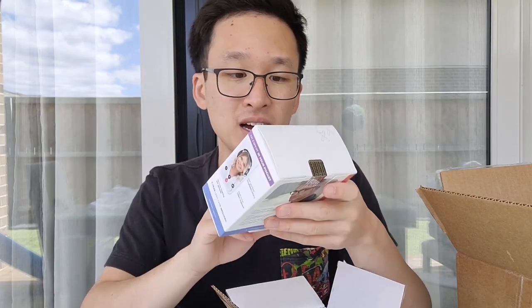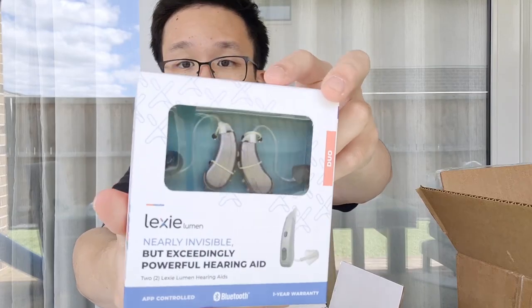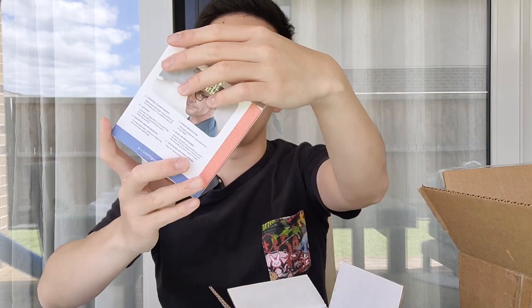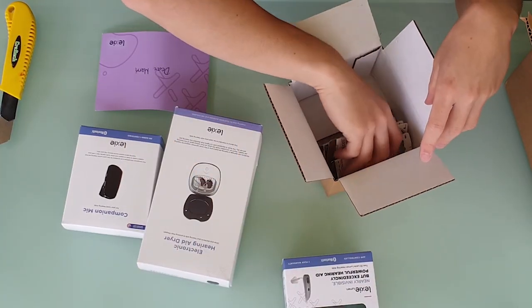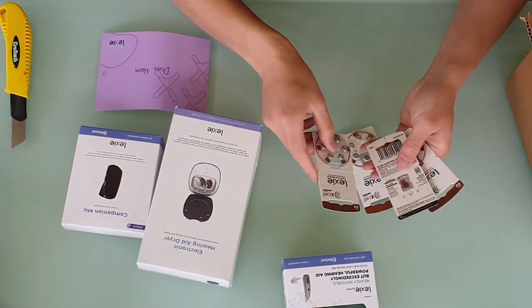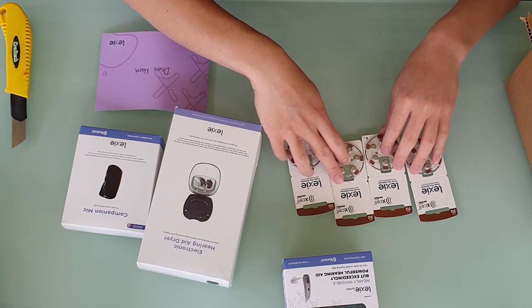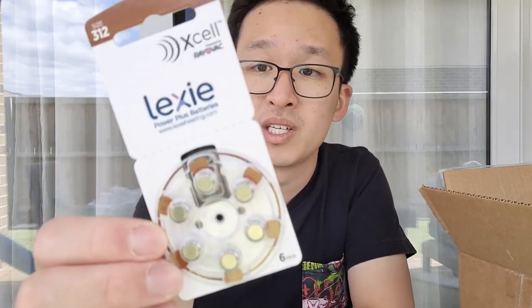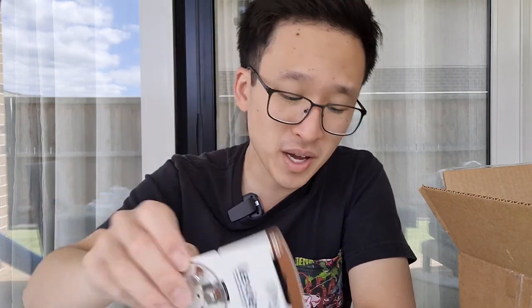And we've got the hearing aids. I've gone with the garden metal gray model — I thought they probably look the best. They also included four packs of 312 size batteries. 312 size batteries are probably the most common batteries when it comes to hearing aids, so those are really convenient.